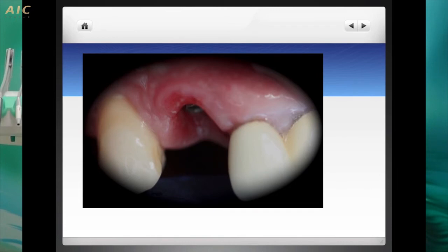And here I can show you, the thing is, soft tissues are not as predictable as hard tissues. For example, nowadays we speak about emotion and history with the DSD, Digital Smile Design, and we all speak about this, but the thing is, we are predicting our results a lot more predictably. Why? Because we are talking about hard tissues.